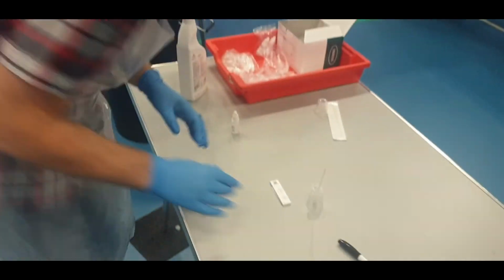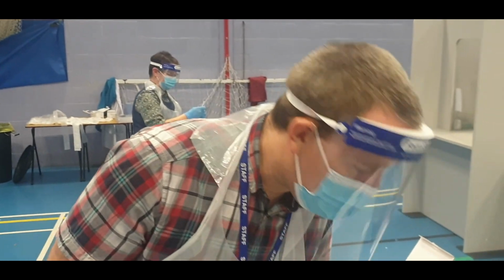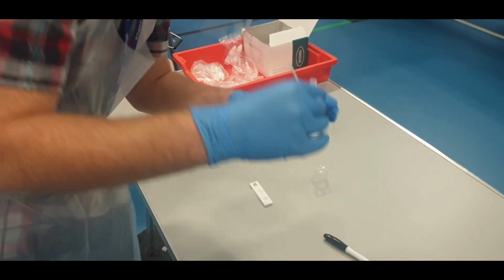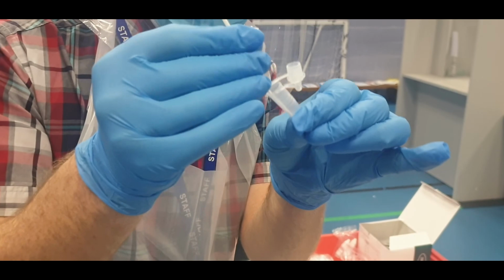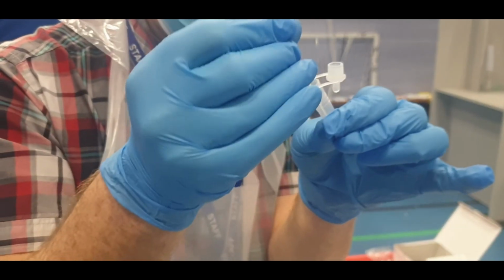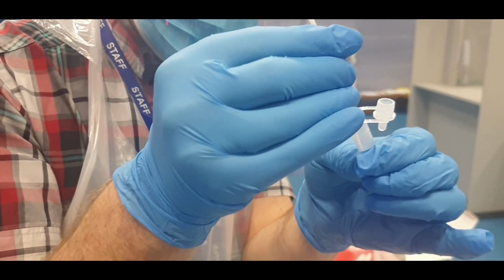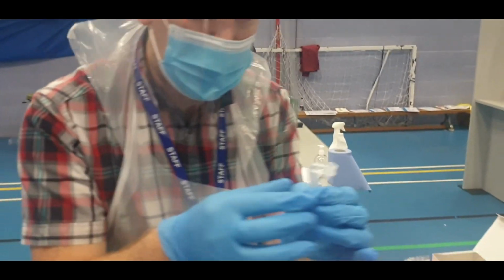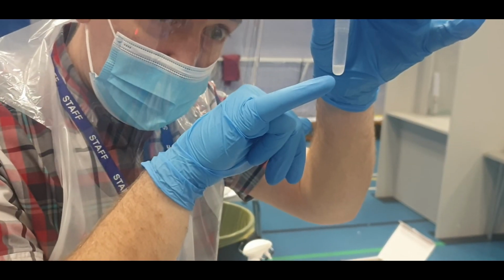Lovely. So here we are doing lateral flow testing. As you can see, it's all go, go, go. The person's just done their test. So in that mixture there, look, that's the extraction solution and their sample. So I'm basically trying to squeeze off as much of the person juice, which may or may not have the virus particles on it, as possible. I do that for 10 seconds. I then pull that out, withdraw that, and that's my sample. That goes in the clinical waste bin. Now I close the lid so we can see the solution here.